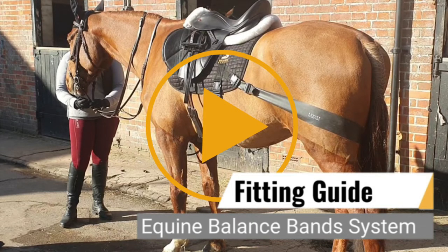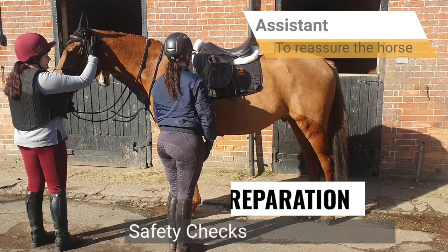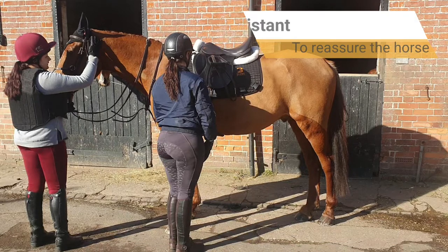This short video guide highlights how to fit, position and tension equine balance bands. Before fitting the bands, it is advisable to enlist the help of an assistant to hold the horse.